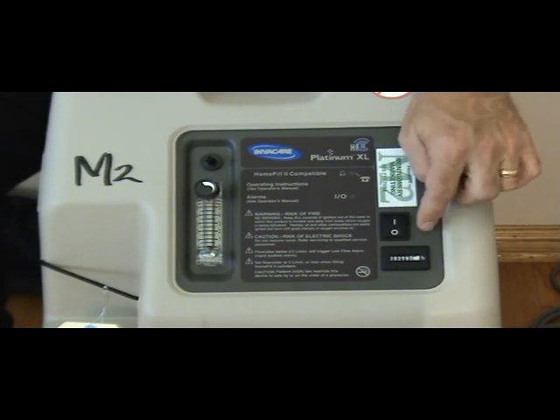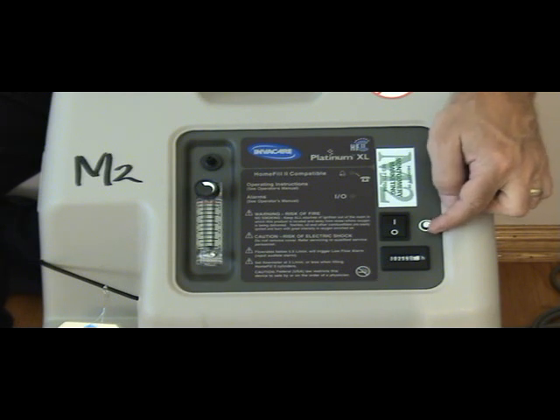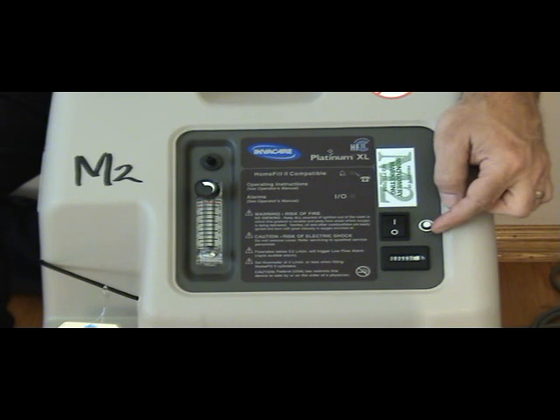To the side here is the surge protector, or essentially it's a surge protector. What this does is, if there's a power surge to the house, this little button, which sticks out about 1/8 of an inch, will pop out. The unit will shut off and the alarm will sound. You're going to hear the alarm in just a second.